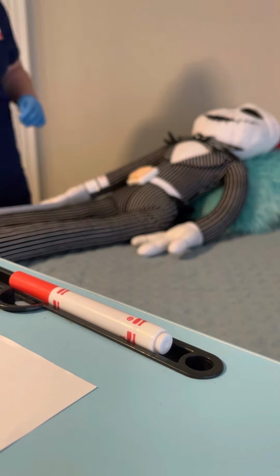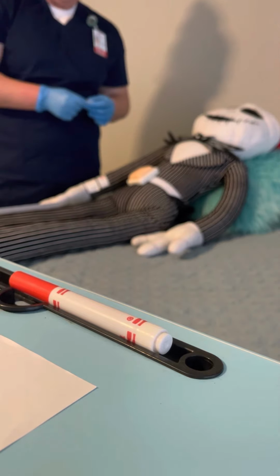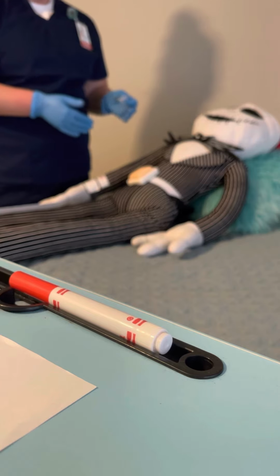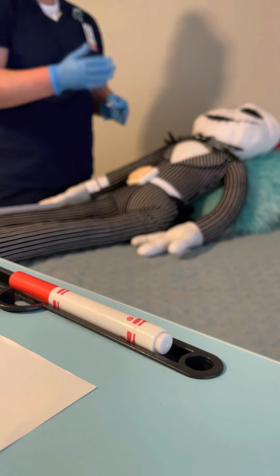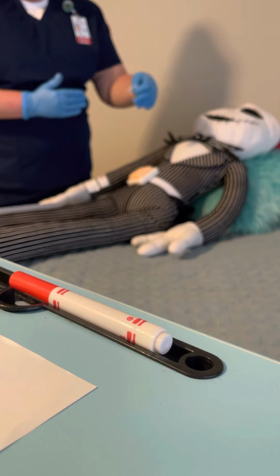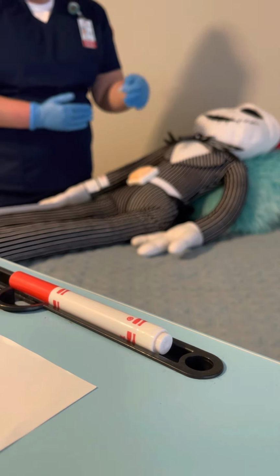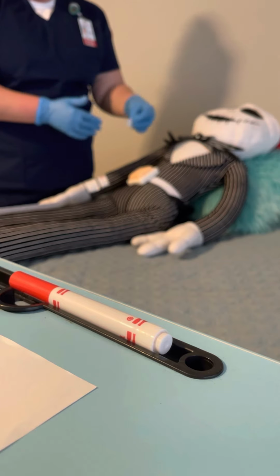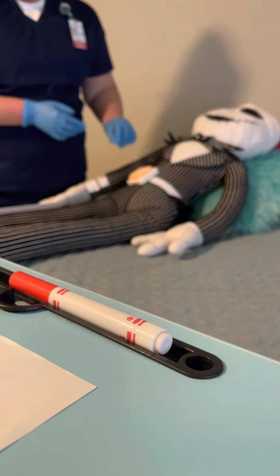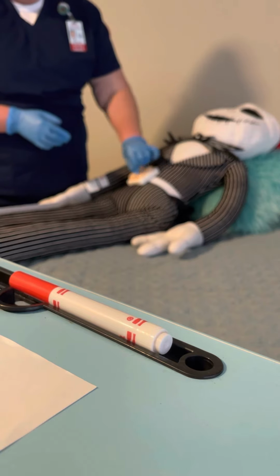This is a subcutaneous injection, so I'm going to do it in the abdomen. So I'm going to go 2 inches away from the umbilicus. I'm not going to go above the costal space. I'm not going to go below the pubic region, and I'm not going to go past the anterior superior iliac spine. So I'm going to clean the site, inner to outer.